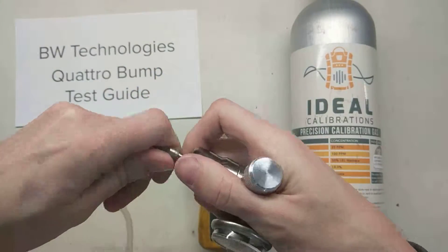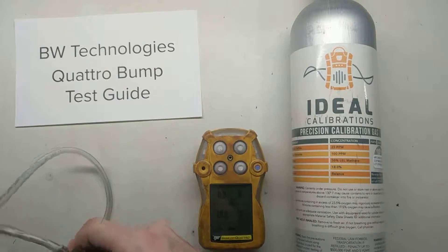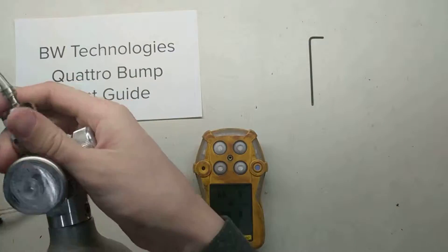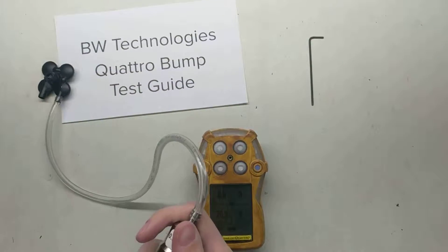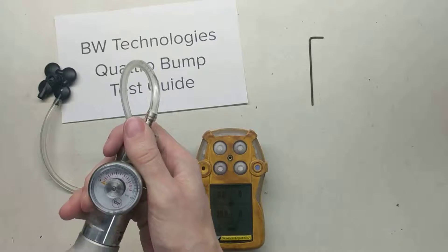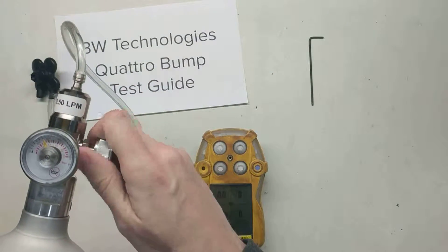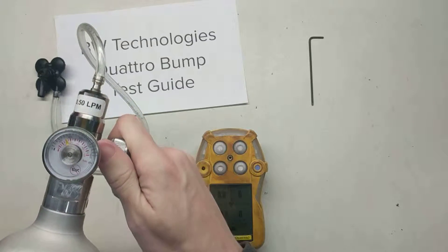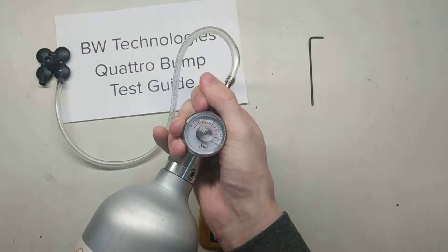We put the calibration adapter on right here. Make sure our valve's open. Grab the cylinder and screw it in. What will happen is we're going to hear it start hissing gas — when it does, we're going to close the valve like so, and then continue screwing the cylinder in afterwards.